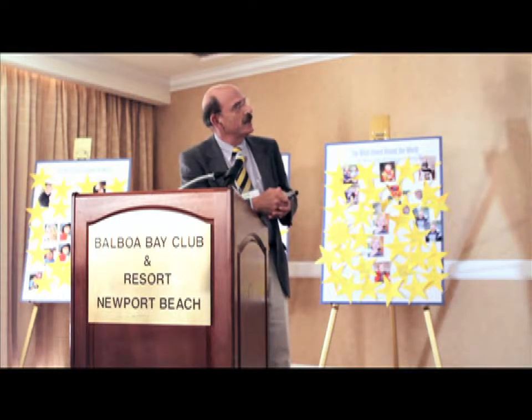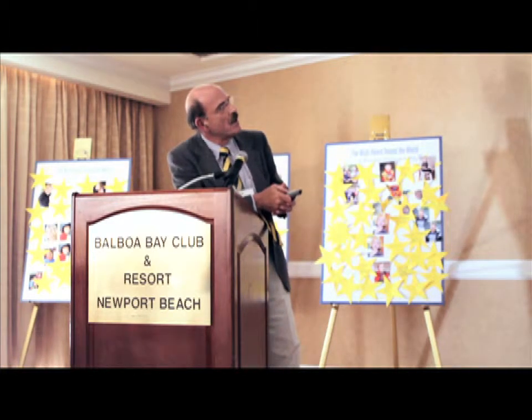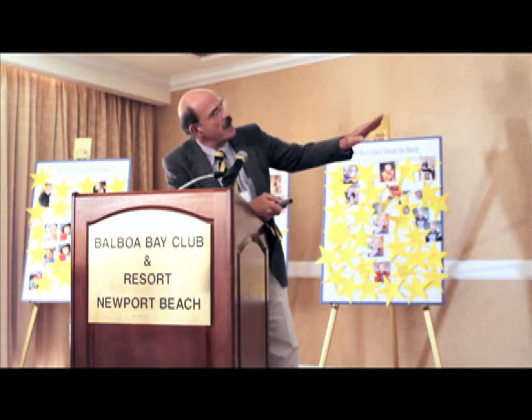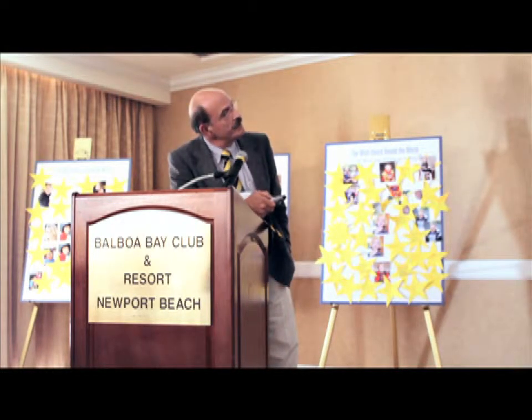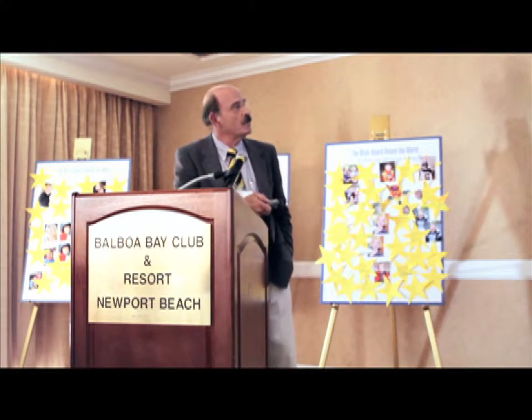Now we've gone on to quantify this using an image processing program, using digital imaging software, in which we can segment out the crystals individually, and that's shown here in a three-dimensional rendering. What we do essentially, and I don't know if you're going to be able to see this either in this excessive light, but this is the optical slice around the epithelium, and as we go in, we're going to see those crystals pop up. We come back to the endothelium, and you're going to see a lot of crystals in the endothelium. Again, stromal crystals are going to show here. Then when we segment out, we'll specifically identify only the crystals. This is this yellow. And then back to the endothelium. And now we can pop out just the crystals alone. And now we have a measure then of the volume of the crystals inside the corneal stroma.